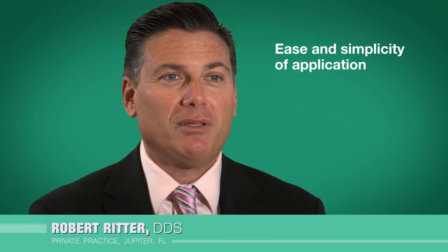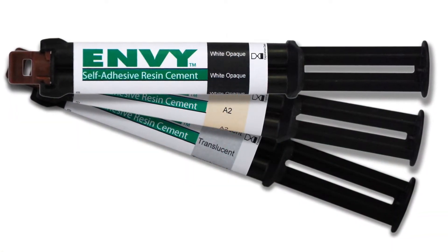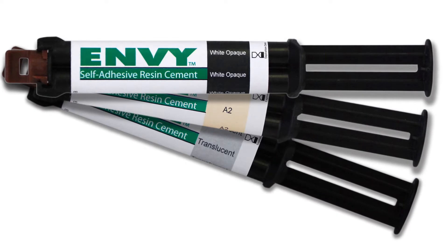I like using self-adhesive cements for a number of reasons. Number one is the ease and simplicity of application. Typically, self-adhesive cements come in dual barrel syringes, so it's auto-mixed. You get the correct ratio when you're dispensing it into the unit itself.